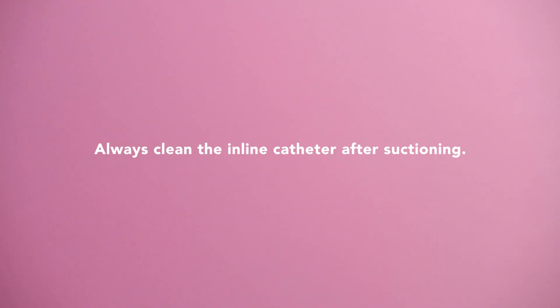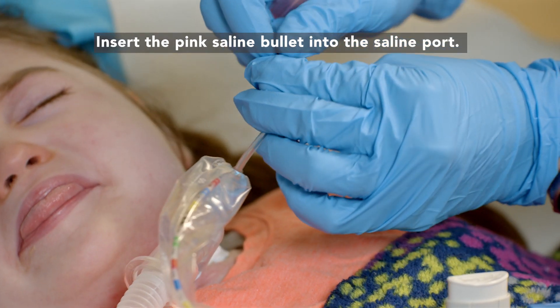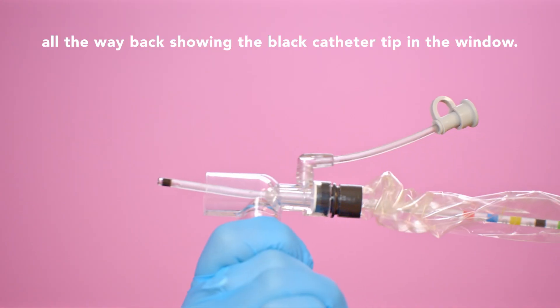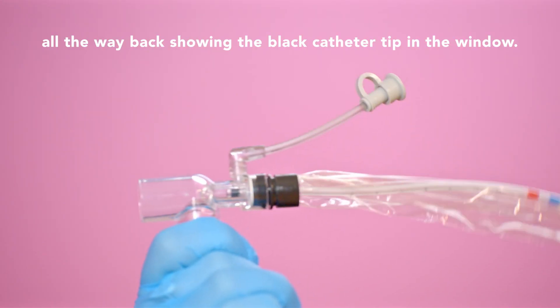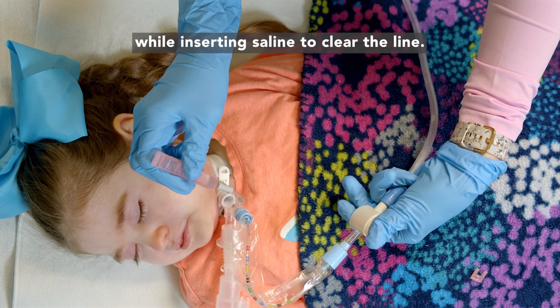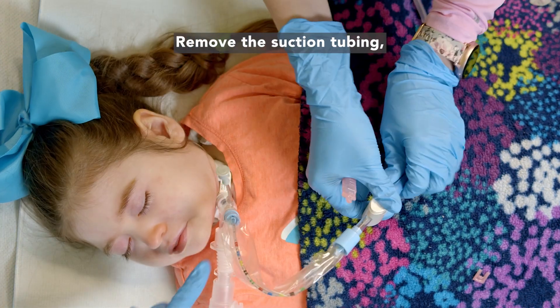Always clean the in-line catheter after suctioning. Insert the pink saline bullet into the saline port. Ensure the in-line catheter is pulled all the way back, showing the black catheter tip in the window. Continuously press down the thumb valve while inserting saline to clear the line. Remove the suction tubing, lock the thumb valve by turning, and turn off the suction machine. If you have any questions, please contact your respiratory educators or nurse educator.